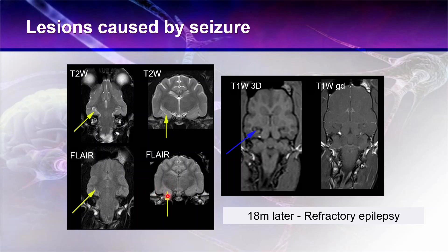In comparison to the last image where this was very swollen, the temporal lobe is much noticeably reduced compared to the normal side. This is much more obvious on the 3D weighted T1 image, where we can see a much greater area of CSF around this region. We do not see enhancement with gadolinium now.